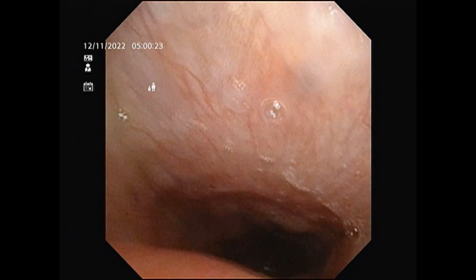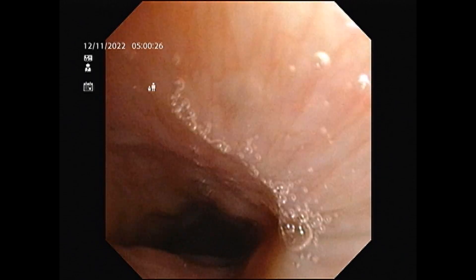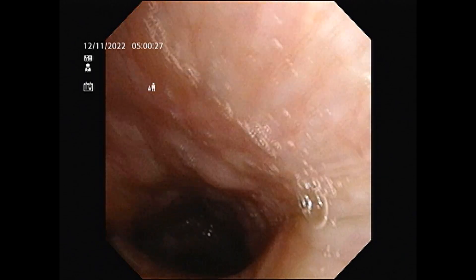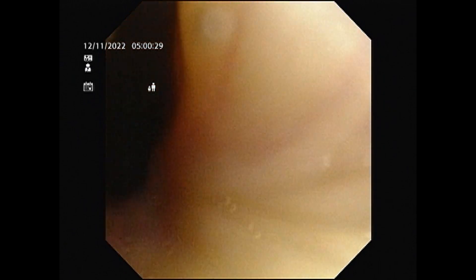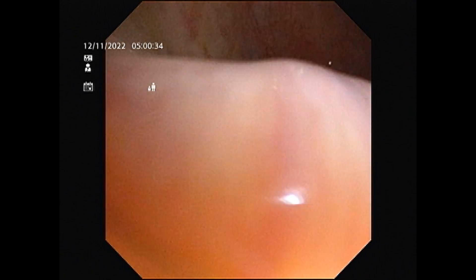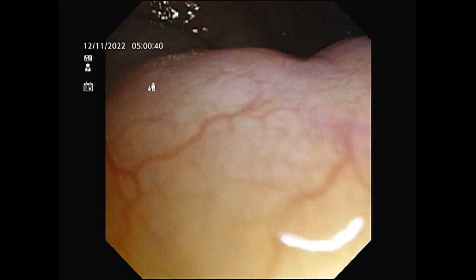What you can see right now is a huge space. Whatever black shadow you can see, like a tunnel — a huge tunnel — at the deep end of which you can see the vocal cords through which the patient breathes. In this clip right now, the patient is awake, fully conscious and oriented. You can see the airway was quite open.